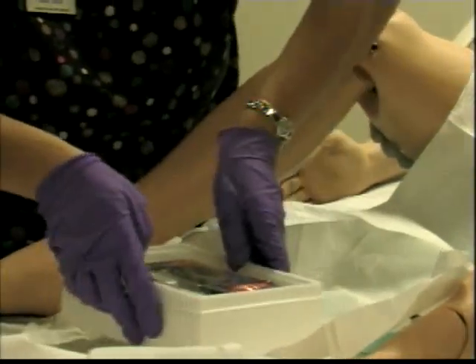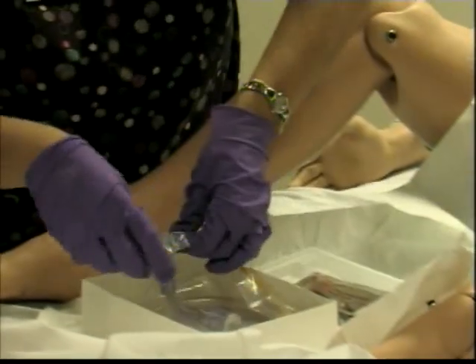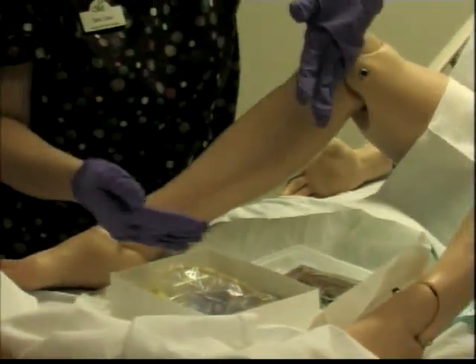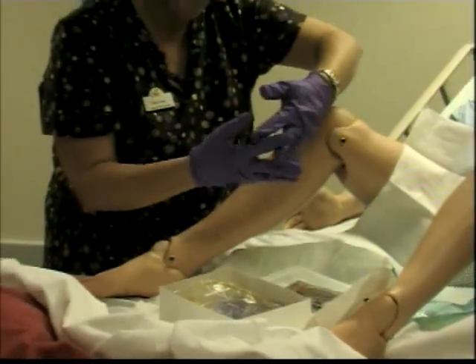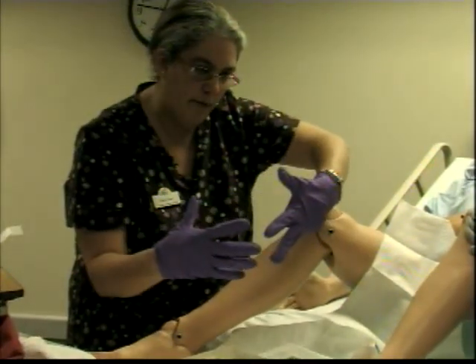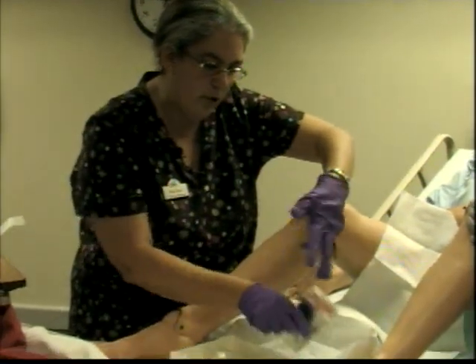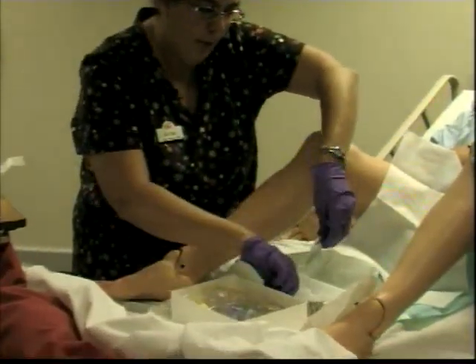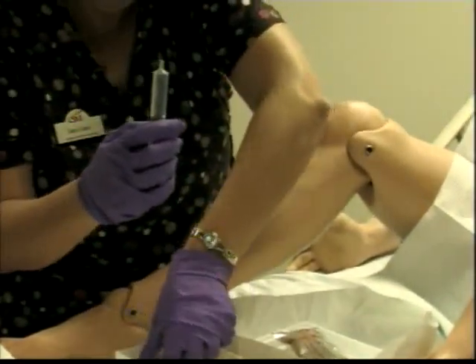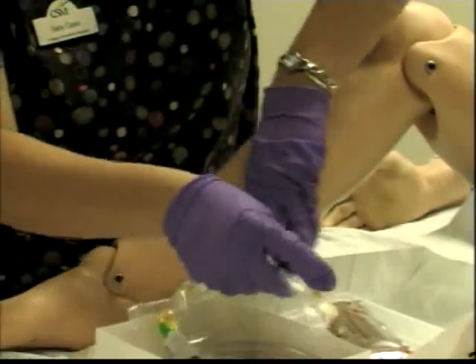I'm going to move my equipment around to have more room and take the cap off. There is some controversy about whether to check the balloon before insertion — the school of thought is that if you check the balloon first, you can stretch it, creating more trauma on the client. For demonstration purposes, I am not going to inflate the balloon. Instead, I'll connect the saline into the port so it's available when needed.